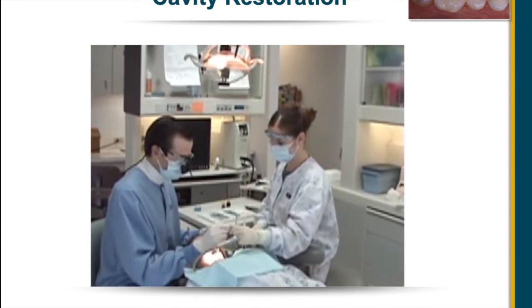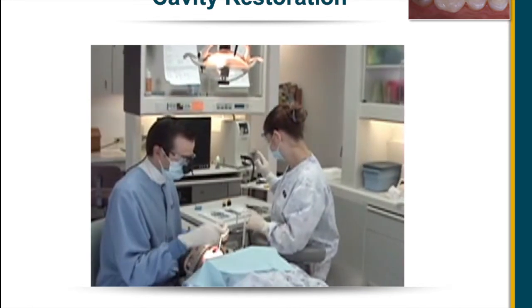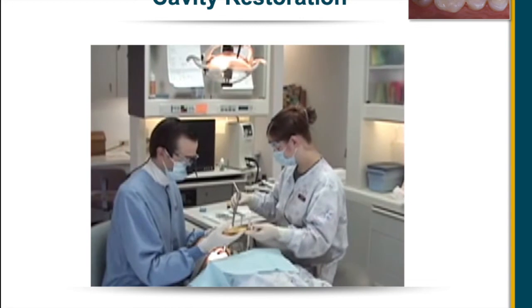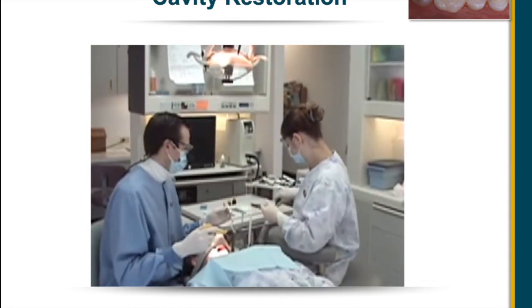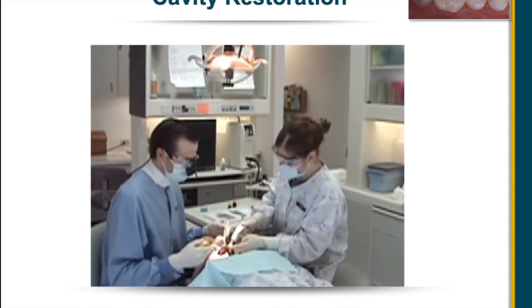Again, notice her posture. Her back is straight, her neck is straight. She has easy access to all the instruments and can present them to the doctor in a comfortable, efficient manner.